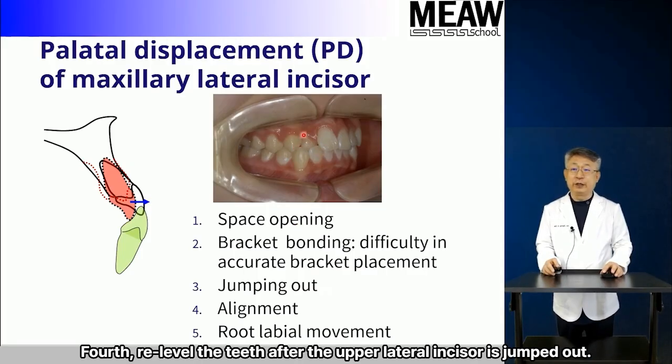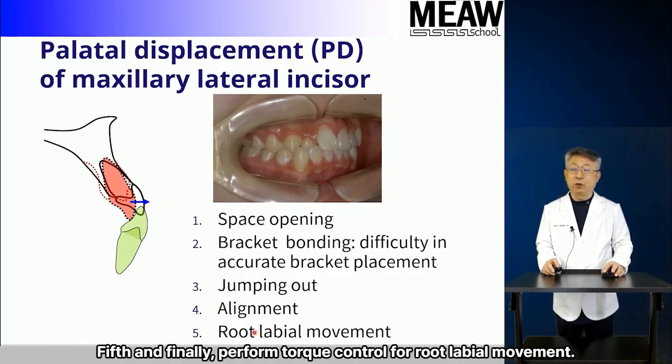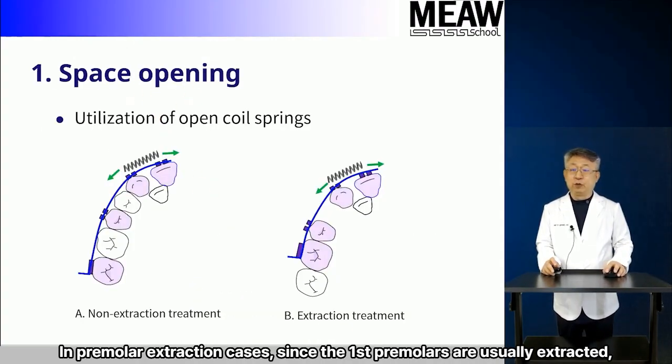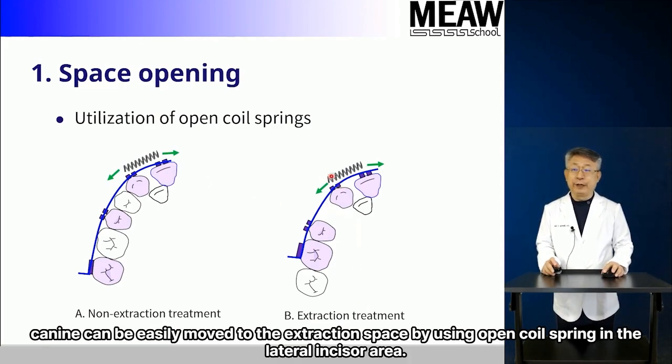Fourth, re-level the teeth after the upper lateral incisor is jumped out. Fifth, and finally, perform torque control for root labial movement. First, it is very important to create space. In premolar extraction cases, since the first premolars are usually extracted, the canine can be easily moved to the extraction space by using open coil spring in the lateral incisor area.